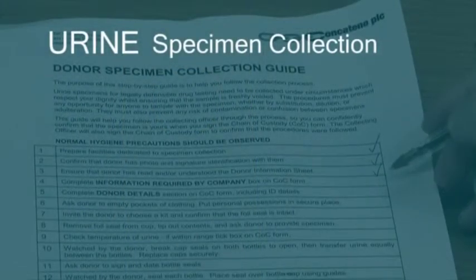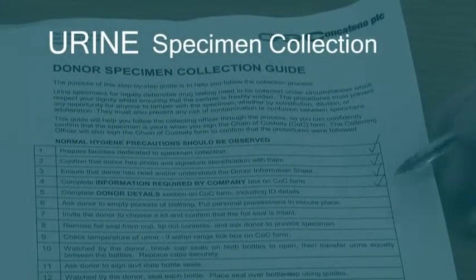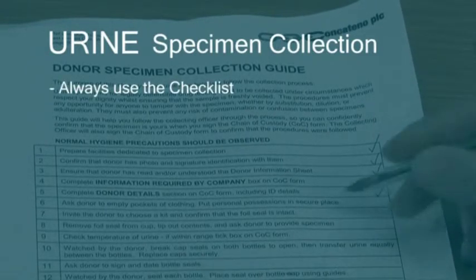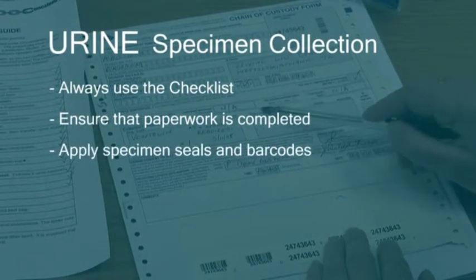Specimen collection. The general rules for collecting specimens are: always use your checklist. Make sure that you complete the paperwork and apply all specimen seals and barcodes as directed.